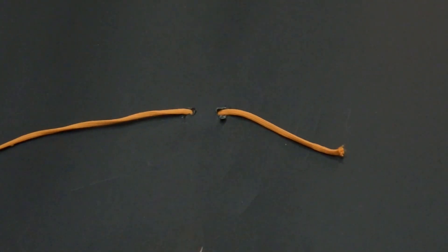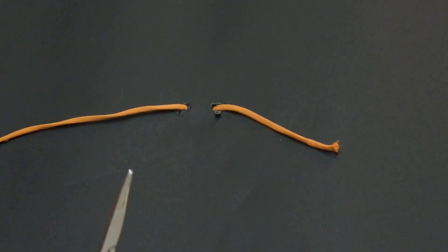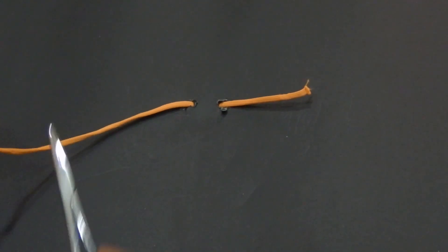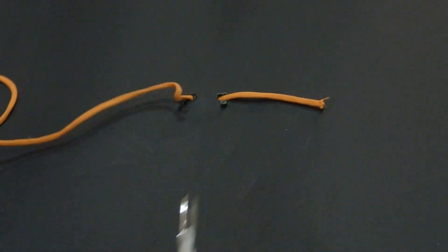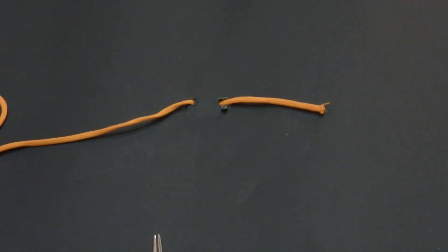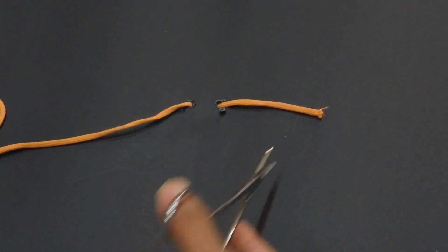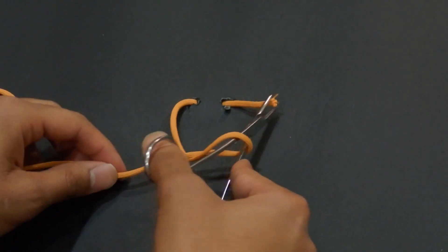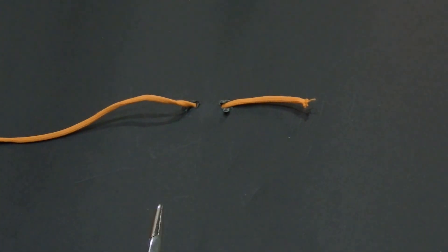For tying by the needle holder, we have three principles. The first principle is changing the direction to make it a square knot — one toward the left side and one toward the right side, continuing like that. The second principle is never to cross your hands. The third principle is to make it short and hold at the tip to make it easy.